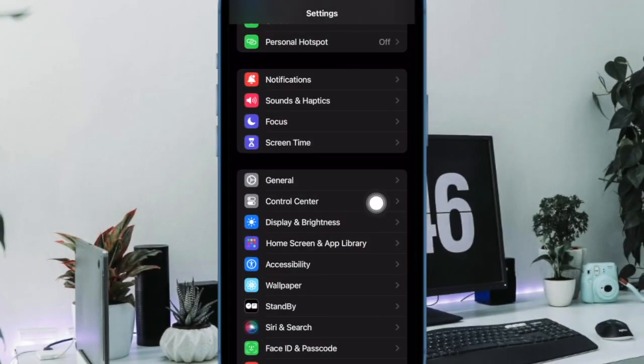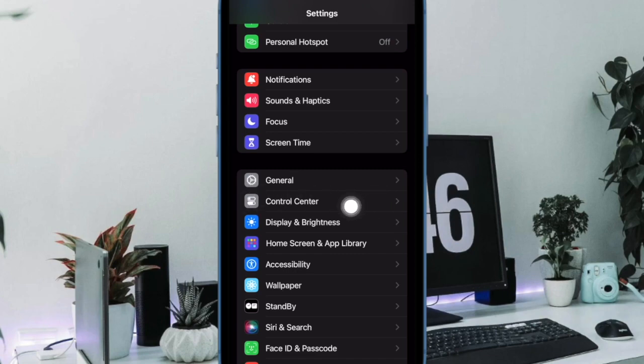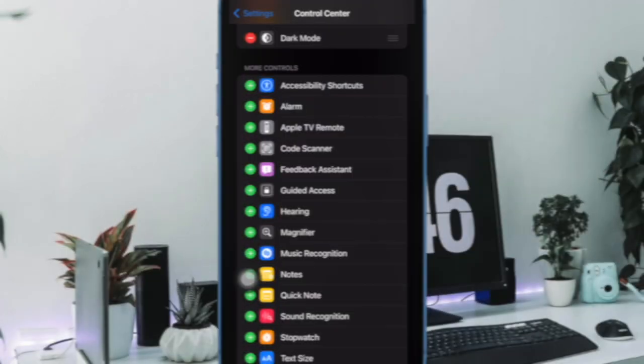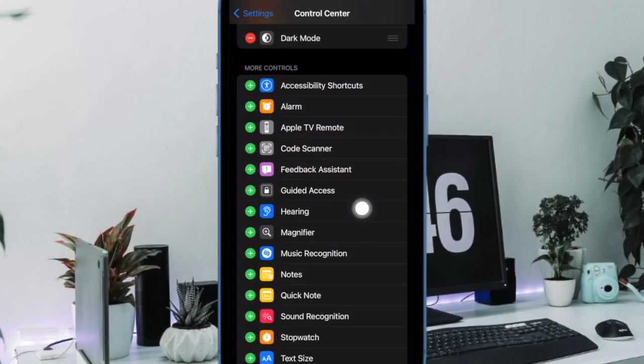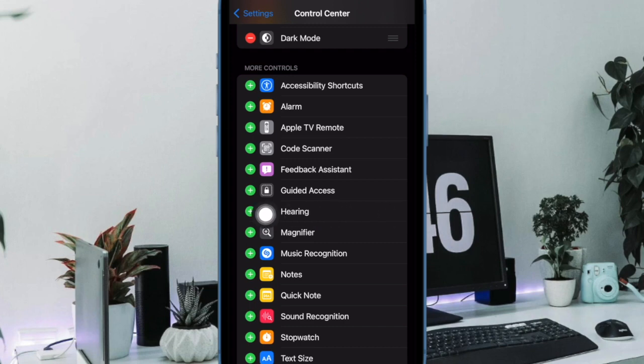Then tap on Control Center. Now scroll down and tap on the green plus button next to hearing to add it to the Control Center.